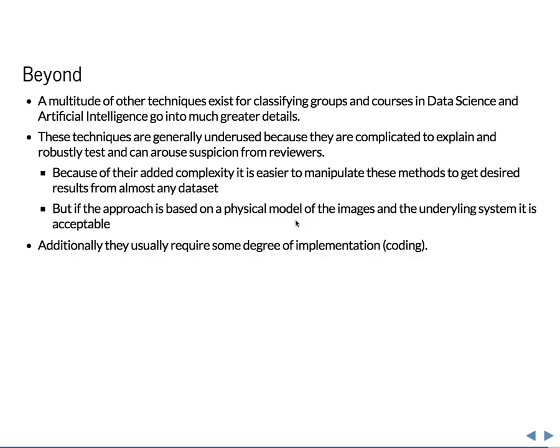If you can justify what you're doing with some sort of physical model or some sort of explanation that thresholds give a really bad result, then it can make sense. With the ultrasound nerve segmentation, I think no one would argue that you can build from scratch, with maybe some fancy edge filter, something that perfectly segments the nerve. So it's clear you'll need a more complicated approach, but for a lot of tasks that isn't the case, and you should then try to avoid building more complicated things than necessary.